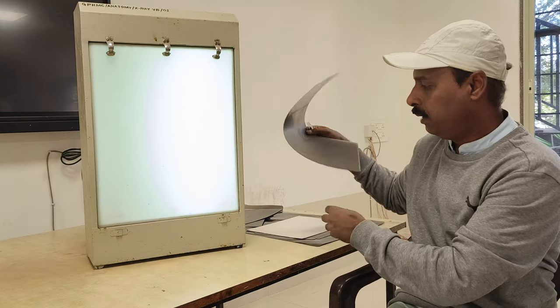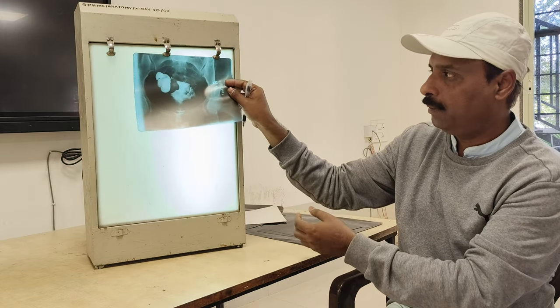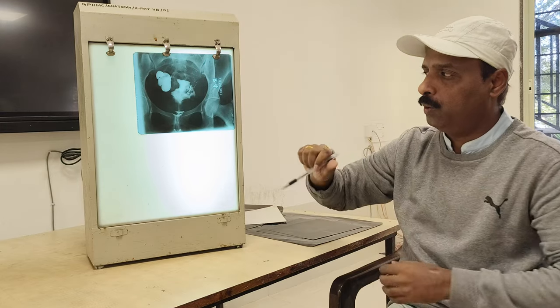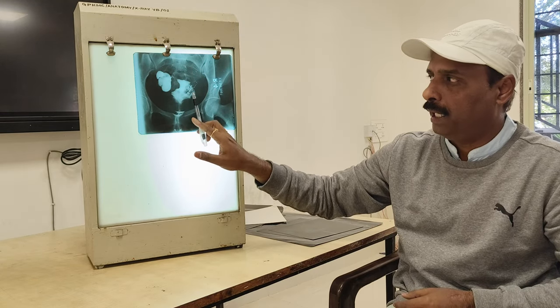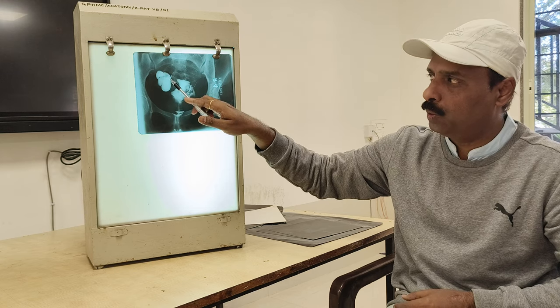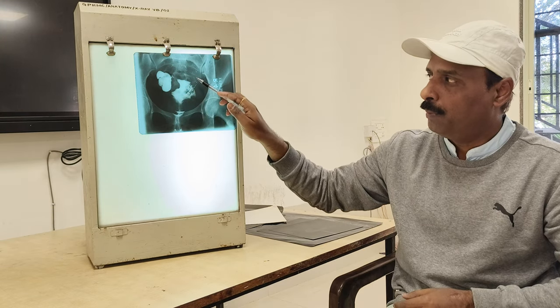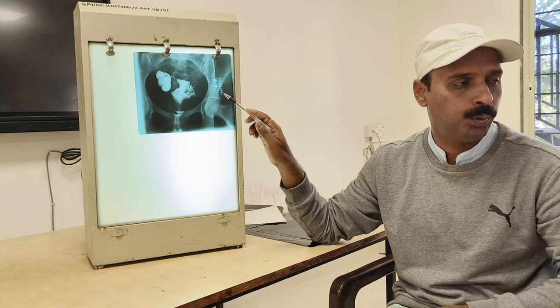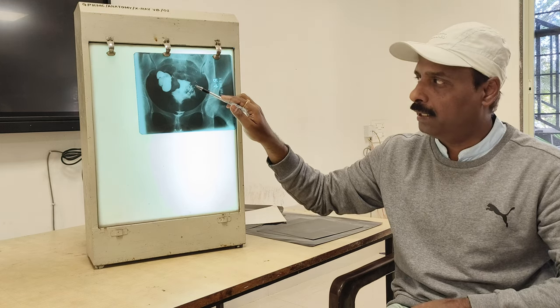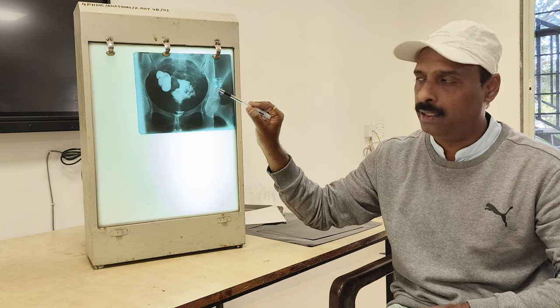Next comes one more, which is hysterosalpingography. We do it to check the patency of the tubes in females. We inject the dye through the cervix and it enters the uterus. From the uterus it reaches the uterine tube and ovary. So this is all the uterine tube, but we are not getting it on the left side, so the left tube is blocked. The left uterine or fallopian tube is not traced, and left-side blockage is seen here.